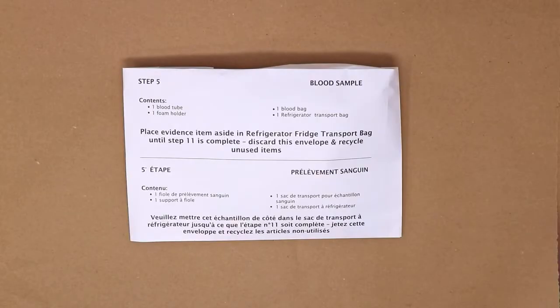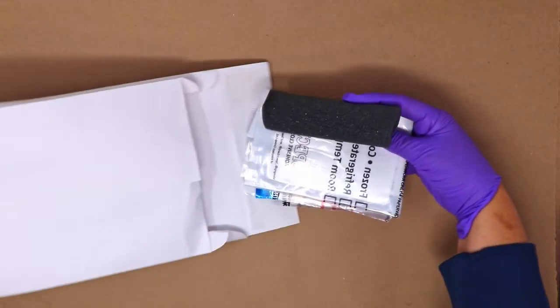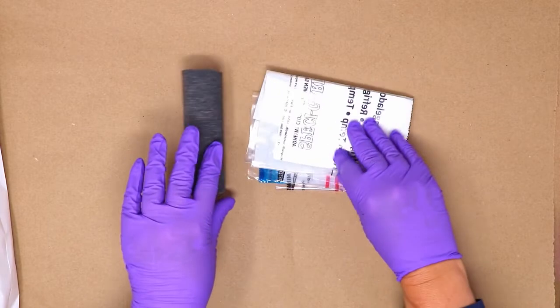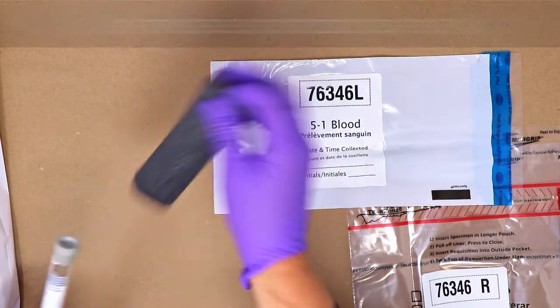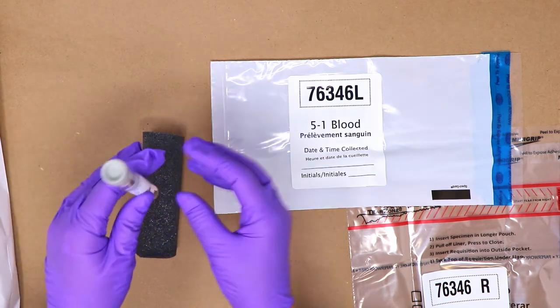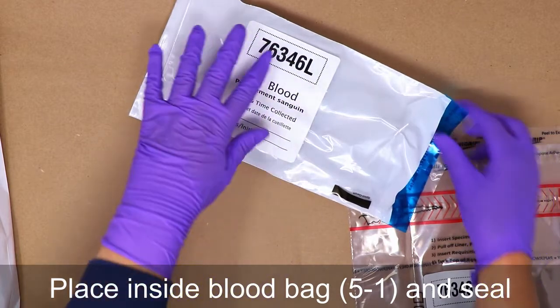The Step 5 envelope includes a number of items used in the collection of the blood sample. A foam holder contains the sample tube, and 2 bags are also provided which were ultimately going to contain the samples. The smaller bag is labeled Blood 5-1. Draw 1 tube of blood using the gray top tube provided. Place into the protective foam holder and place that inside of the blood bag 5-1.